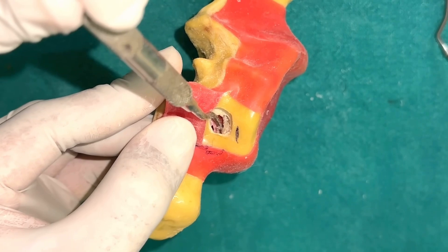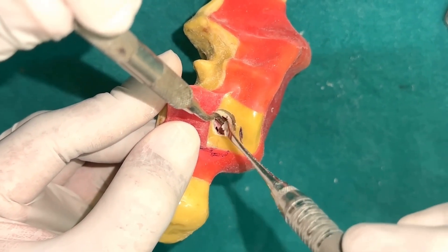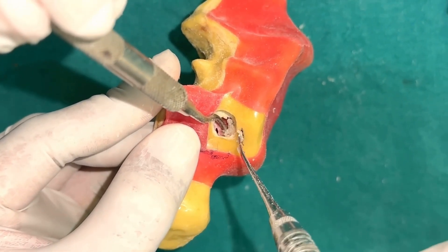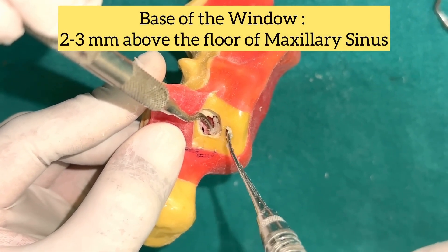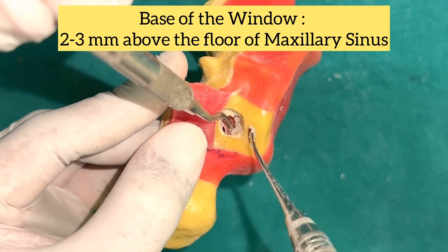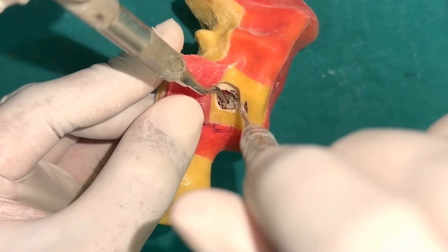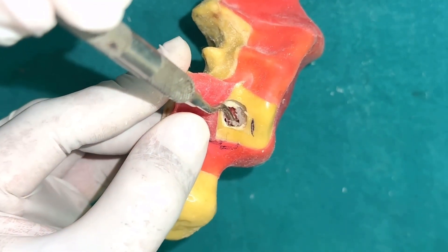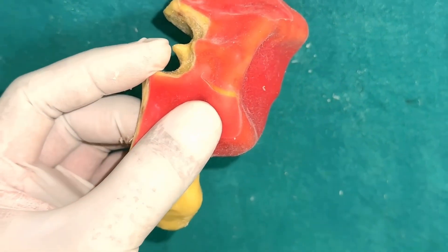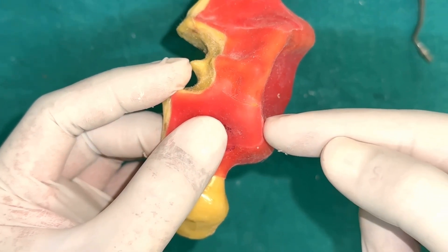Once the packing is done, we can suture it back. For retention of this bone graft, the base has to be roughly above where the height of the bone is ending — otherwise the bone graft won't be retained. Once we have condensed the bone graft, we can remove the instruments, place the flap back, and then we have to wait for bone formation to occur. After that, an implant can be placed.